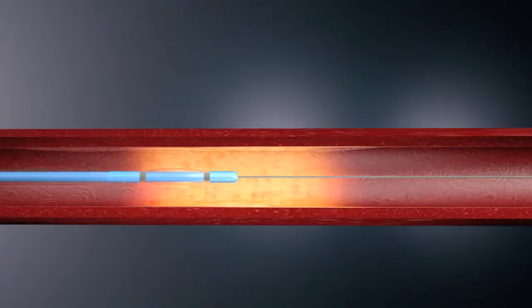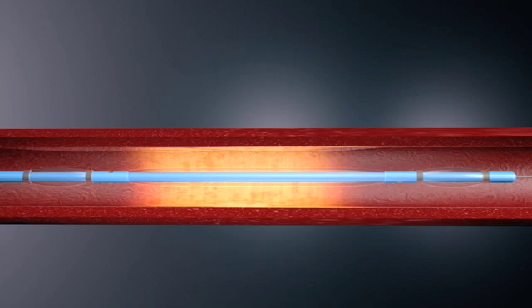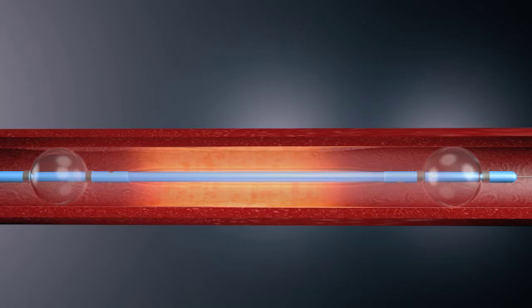The catheter is advanced over the guide wire into the area to be treated. The proximal and distal occlusion balloons are inflated, trapping blood within the treatment chamber.